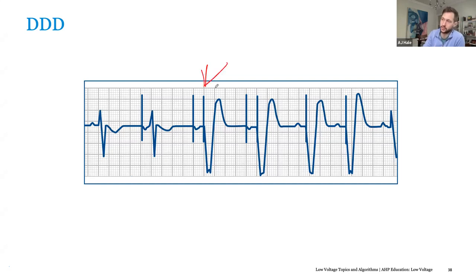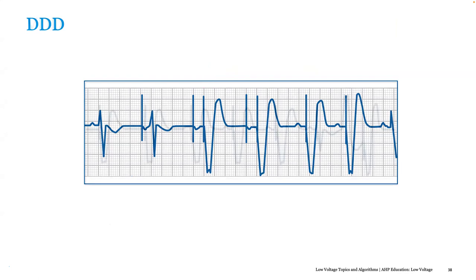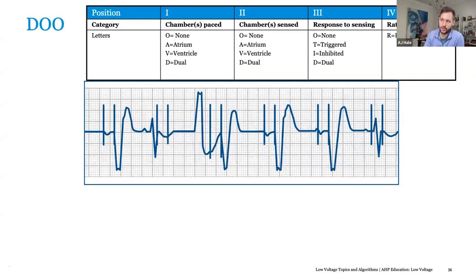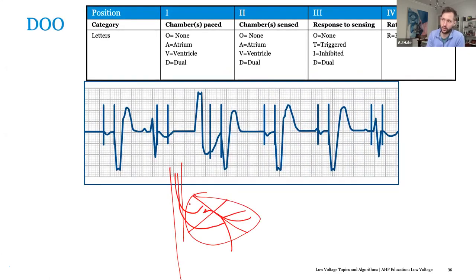We'll go into deeper details with that. But in general, what we're trying to do in these cases is extend your ventricular pace as long as possible to let this intrinsic event occur. So if this conduction is going to occur, we give it as much time as possible, so we're not pacing this patient needlessly. Does that all make sense? Yes, correct. Perfect. So we'll keep moving, and when we get to DDD, I'll talk into this in more detail if that works.